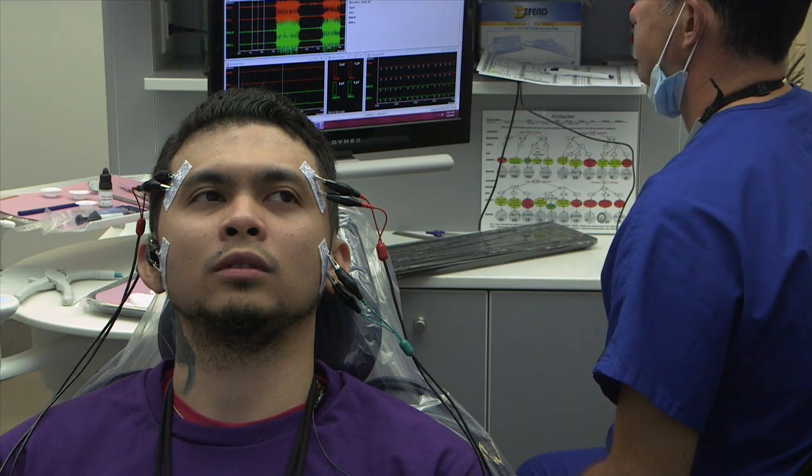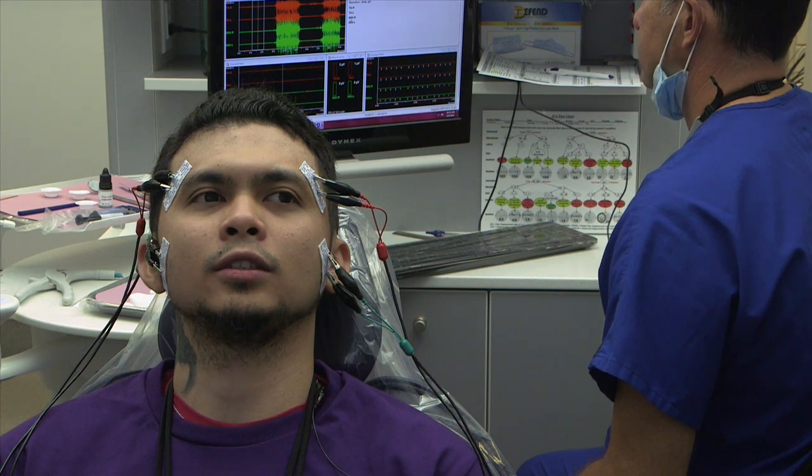We're often asked if the electrode leads that people see in the videos are a TENS unit. No, we don't need TENS. Those leads are measuring the muscle activity levels before disclusion time reduction and after disclusion time reduction. TENS is an artificial method of relaxing muscles. It's very useful for that, relieving pain. It has a lot of benefits, but it's not a permanent correction. So people get TENSed and then their symptoms come back. It's a temporary thing. It's like taking an aspirin for a headache.